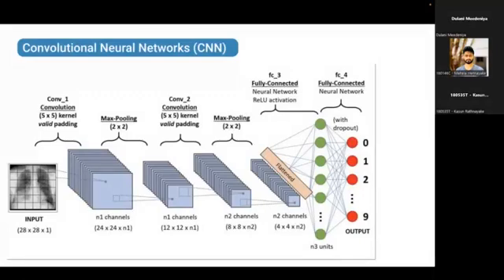It looks for smaller patterns or features like edges and corners that are present in the image. As you can see, it does this by sliding a small window called a kernel across the image. This process helps the network to detect basic shapes and structures.